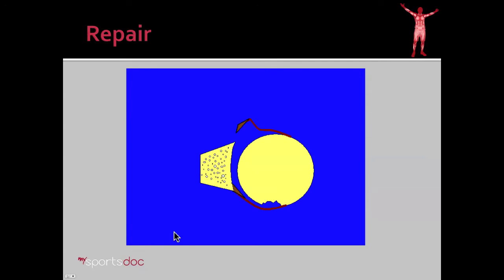So how is this treated? You can see as the shoulder has been reduced and put back in place, that doesn't mean that the ligaments and the labrum fall back into place. So if this is allowed to heal like this, or not heal at all, you can see how the check rein to anterior instability is now gone, and this would allow the shoulder to dislocate on a recurrent basis. With the development of arthroscopic techniques, we're able to repair this by placing an anchor in the front of the glenoid which has stitches attached to it. We then use a special suture passing device to pass the stitches through the glenohumeral ligament and around the labrum, so that when we tie them down, the labrum and the ligament are reduced back to their anatomic position on the glenoid surface, and if allowed to heal, will prevent dislocation of the shoulder in the future.